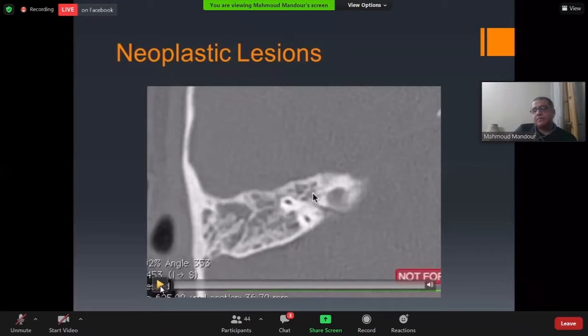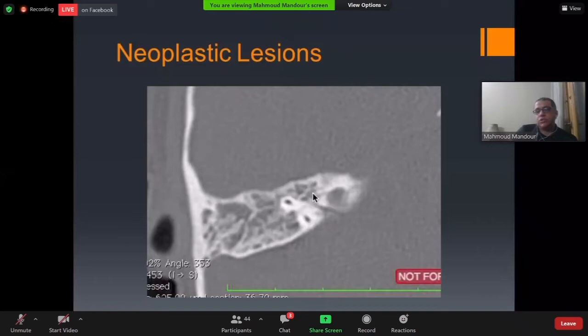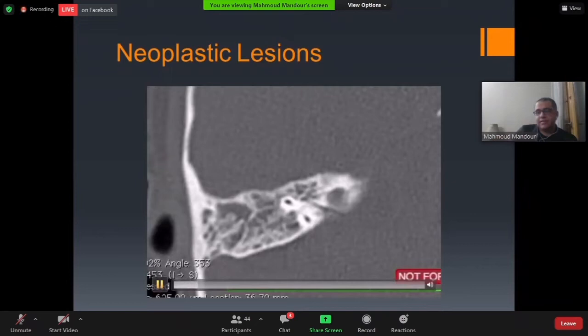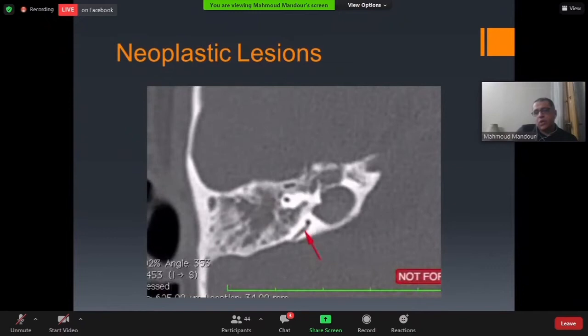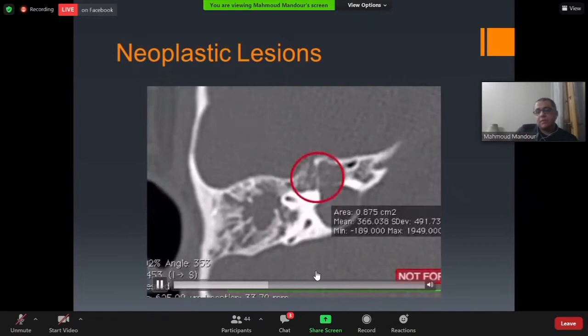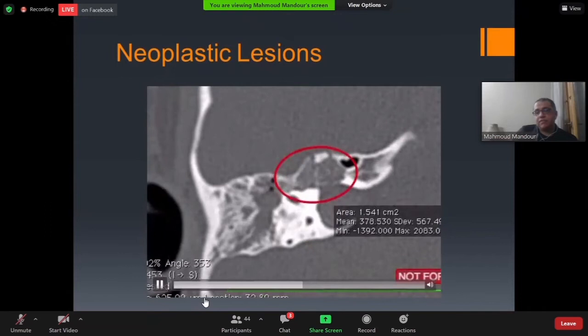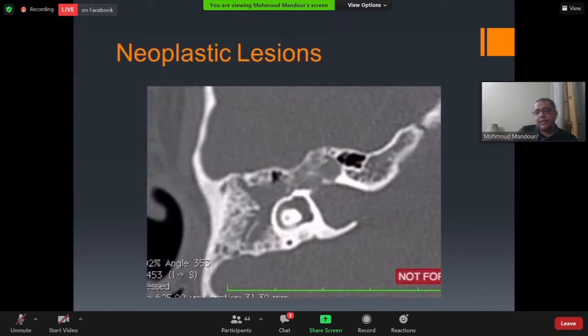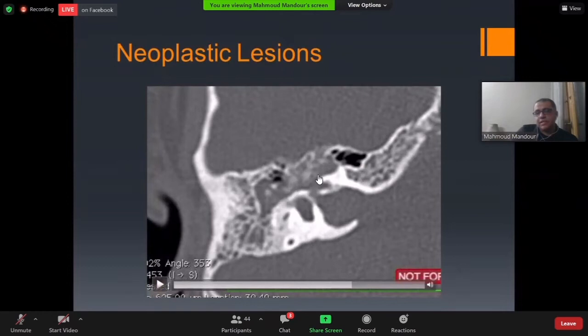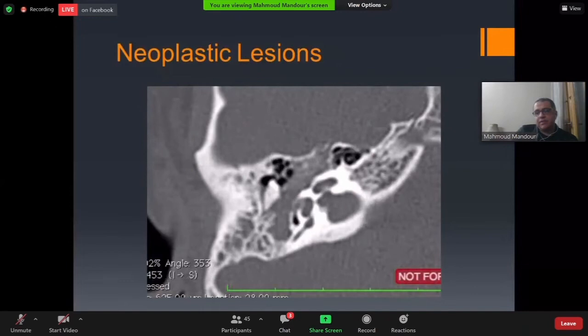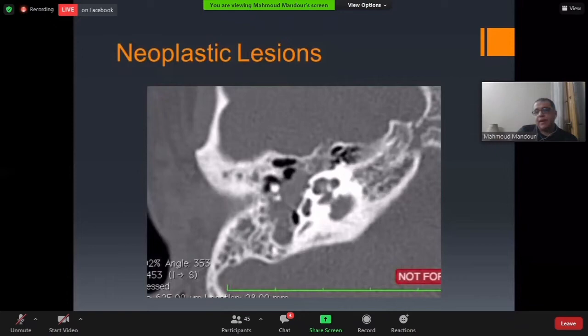A video case illustrating serial CT reading: at the level of the superior semicircular canal, we then see the posterior semicircular canal. Notice the ballooning of the IAC and an osteolytic lesion at the site of the first genu of the facial nerve. Moving downward past the vestibule and lateral semicircular canal, there is clearly a destructive osteolytic lesion at the first genu continuing into the epitympanum.